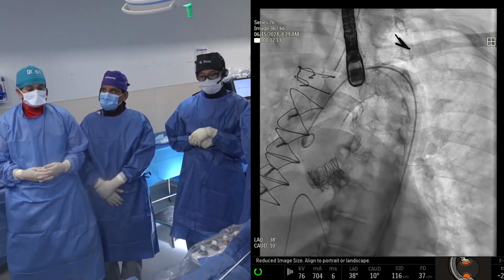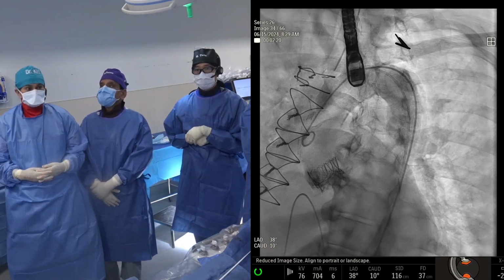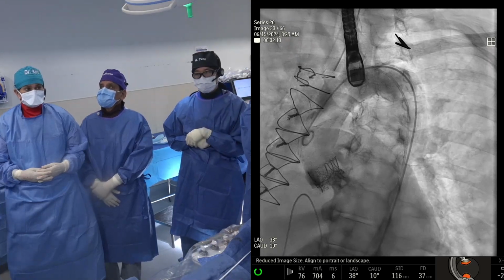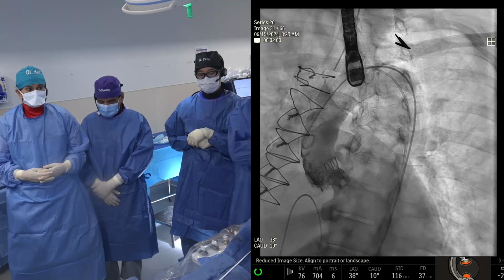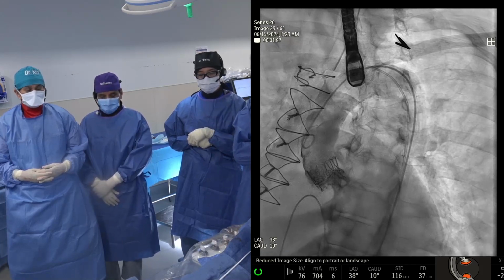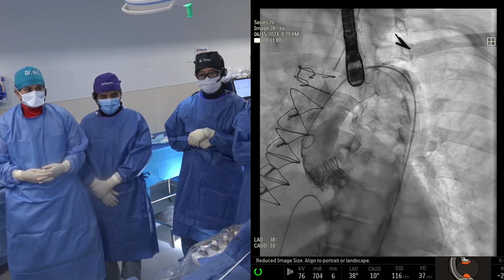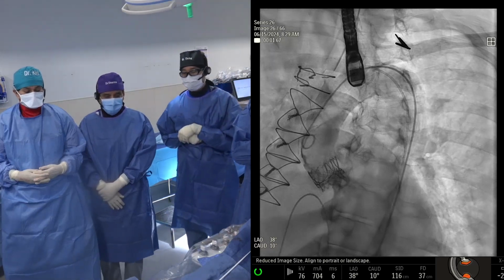I was going to ask you, again, for the benefit of the audience. Obviously, this was not a case for cerebral protection, primarily because of the previous aortic arch dissection in the aorta, and the radials were poor. But what's your strategy for valve in valves with a degenerated valve like this? Is cerebral protection your norm in such cases? 100%. Yeah. Okay. And now we're actually getting into a few other trials.